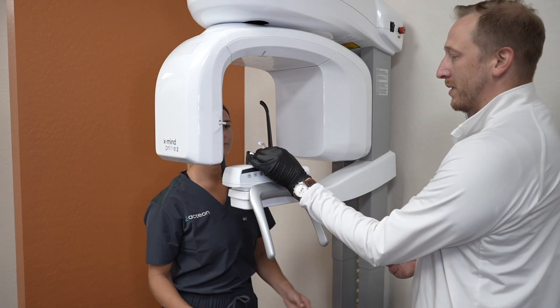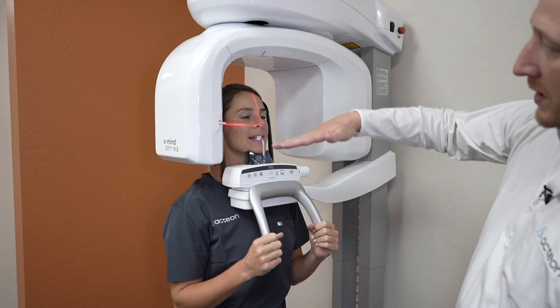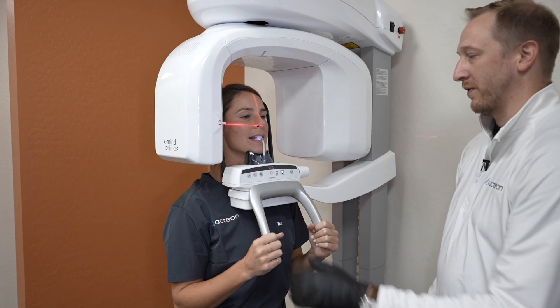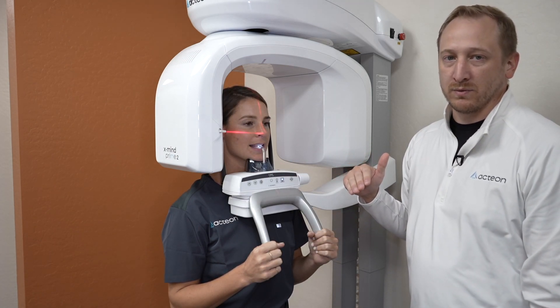Sheridan, come ahead and step in and put your teeth right in between the bite stick. Notice when we turn on our laser that the ala tragus line — Sheridan is tilted too far forward, the anterior of her is too far up. So we're going to bring this down just a little bit right there. We want the maxillary occlusal plane to be horizontal and level with the floor.